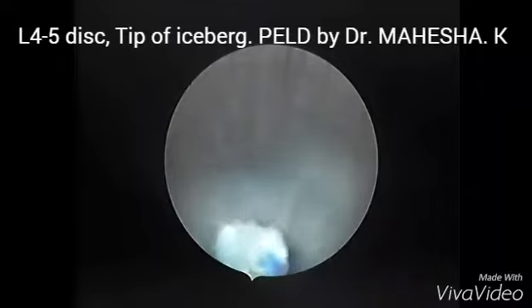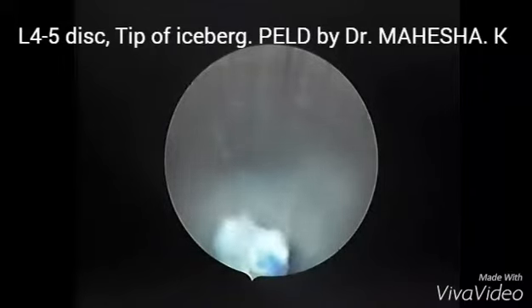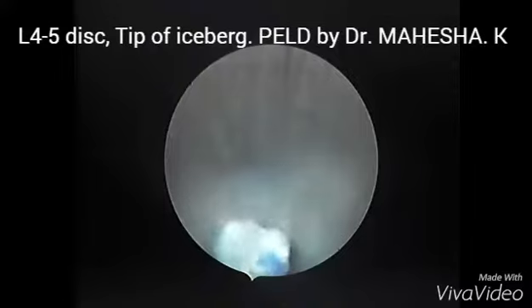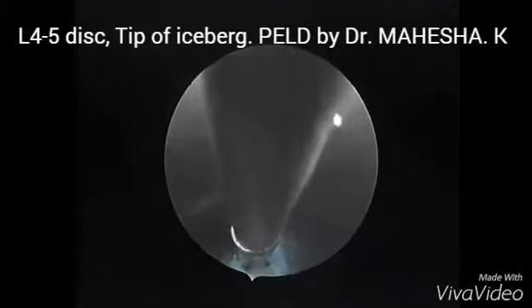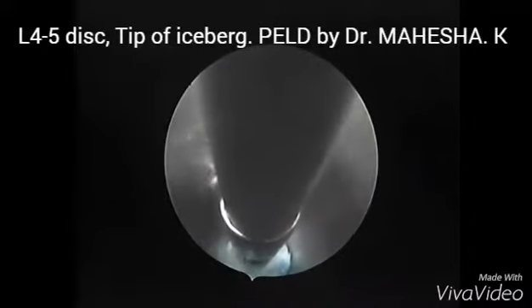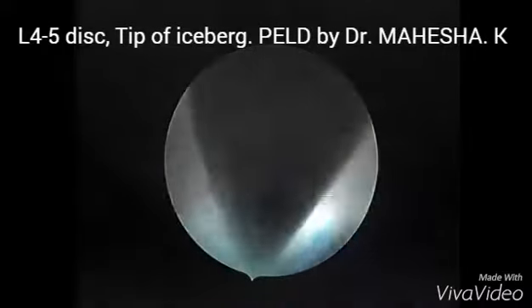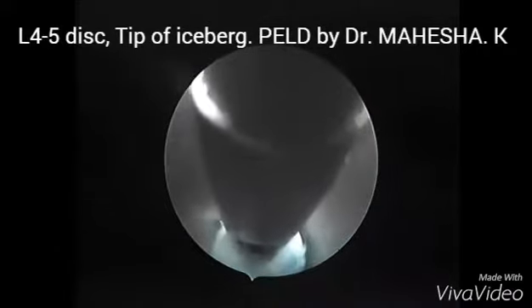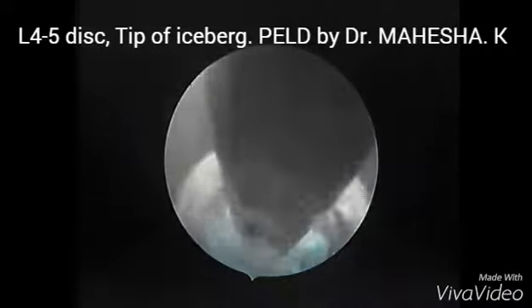Now I have changed the disc forceps. I am going in again and trying to grab this fragment. Now I have caught hold of this fragment. When I catch this fragment, the patient experiences radiating pain in the lower limbs. But once the fragment has come out, the leg pain is completely relieved.